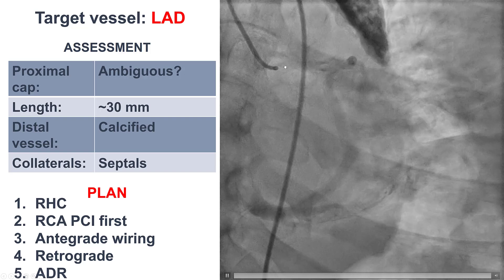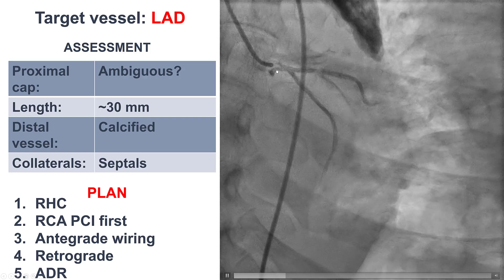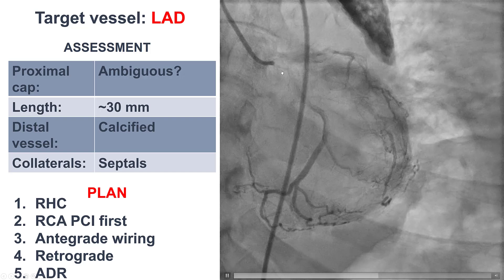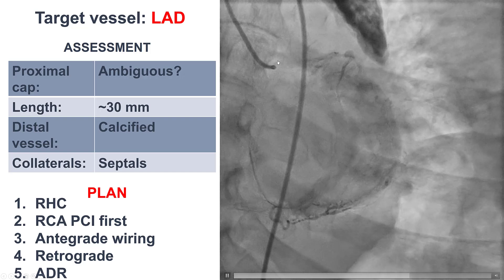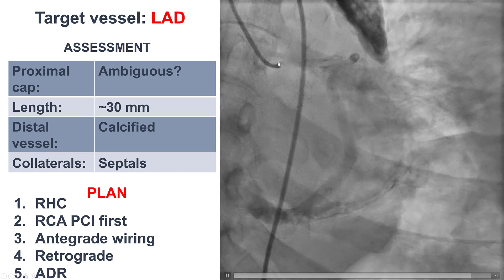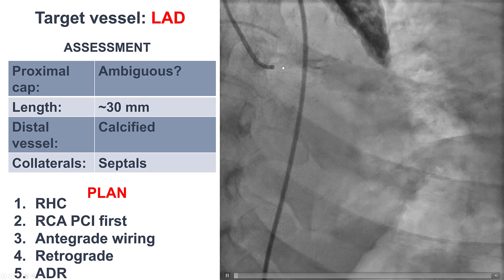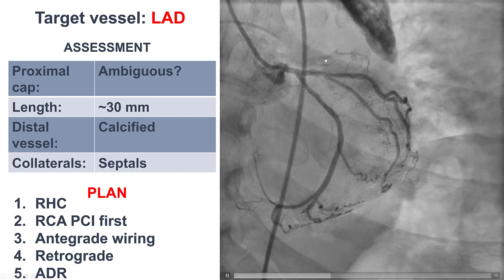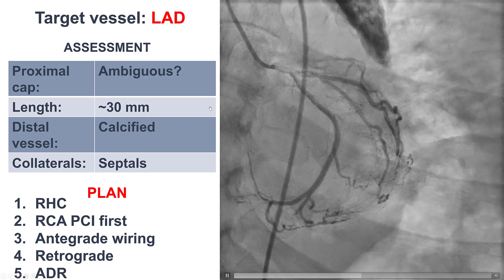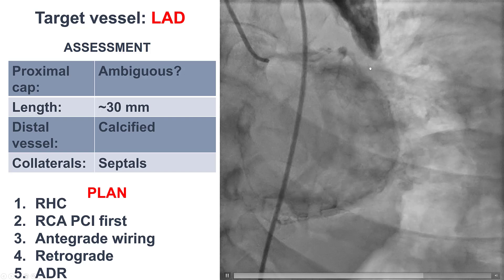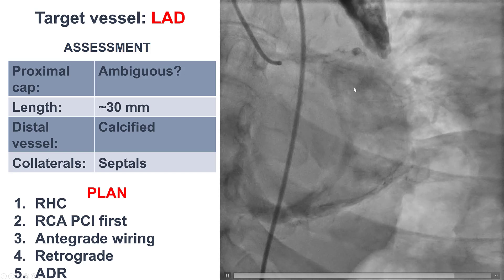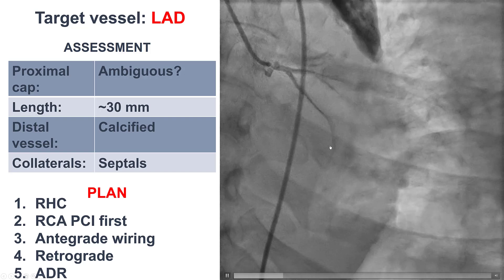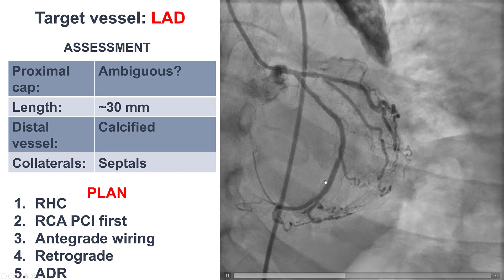The LAD CTO has a relatively ambiguous proximal cap. There may be a small nub, a small entry point into the CTO at the left main, but this was not clear. The length is approximately 30 millimeters. The distal vessel was heavily calcified and filling mainly via septal collaterals from the right coronary artery.